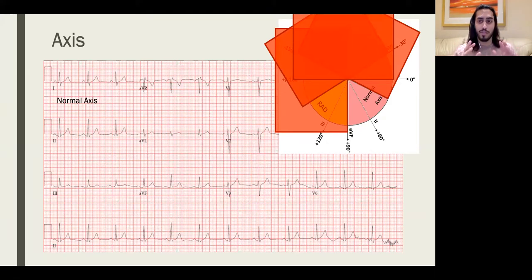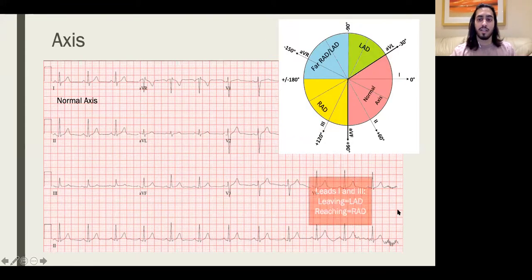But basically, if you spend 20 minutes looking at the axis during the ward round, when someone hands you an ECG, you look as in that's not right? You need to find a quicker way to do it. So I've got a little trick that I think a lot of people use, which is an easy way to calculate axis, but now you understand, you'll know where it's coming from. And that's basically, I just look at 2 leads. In day-to-day, as an F1, you'll see tens of ECGs per day, and you'll have to be able to triage them to see which ones are important to raise to your seniors and which ones aren't.